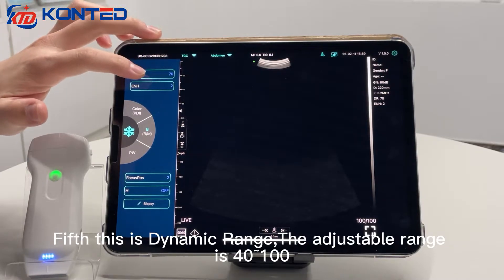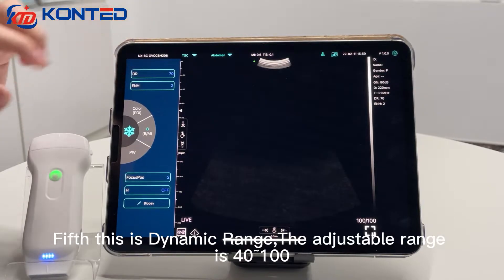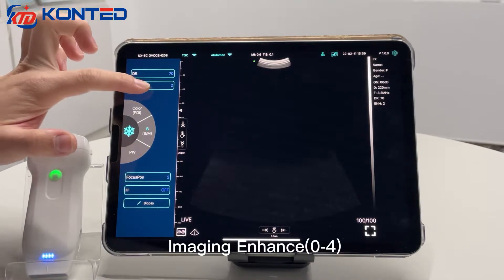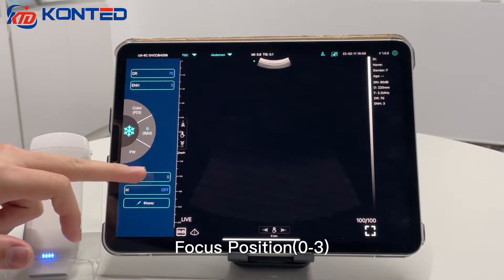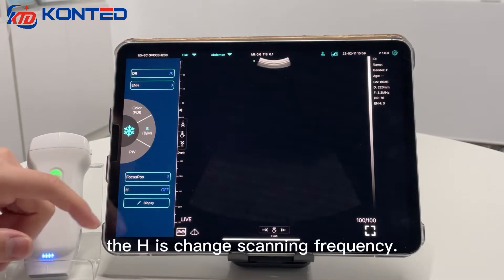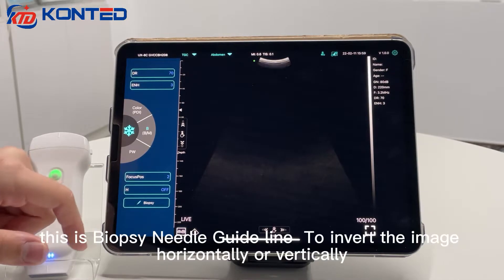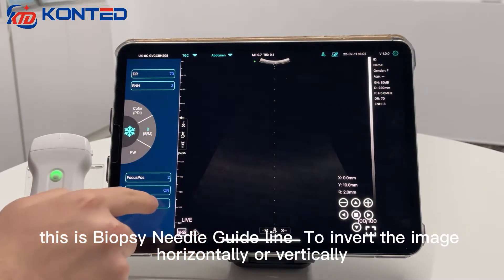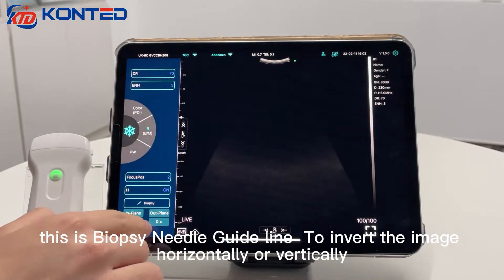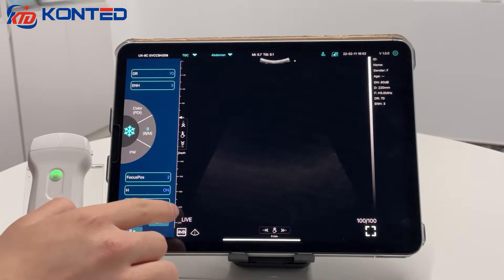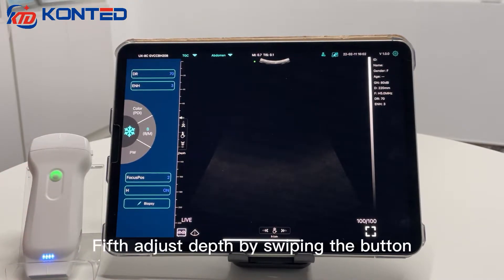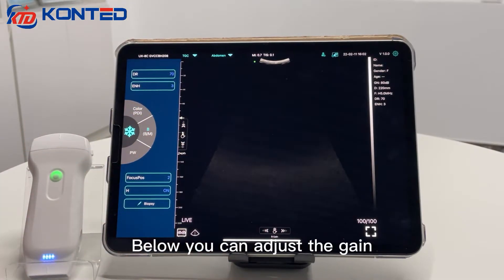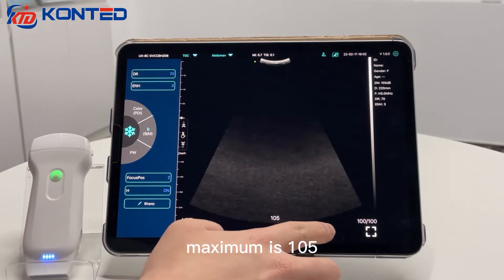This is the dynamic range; the adjustable range is 40 to 110. Adjust here and the right side will also change. Imaging enhance. Focus position. The edge is for changing scanning frequency. This is the biopsy needle guideline. Adjust the depth by swiping the bottom. You can also adjust the gain; minimum is 30, maximum is 105.